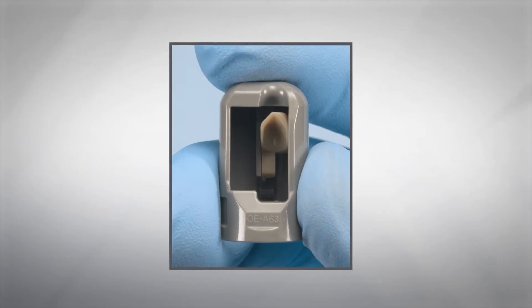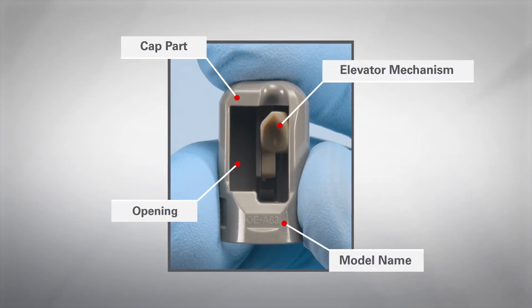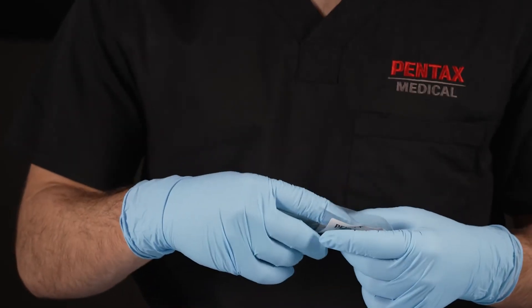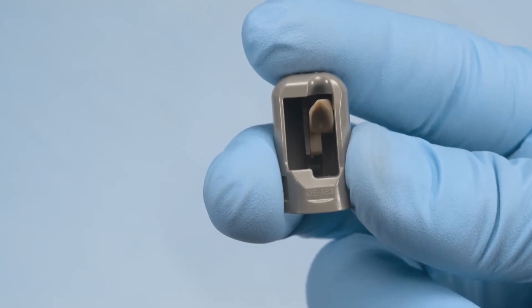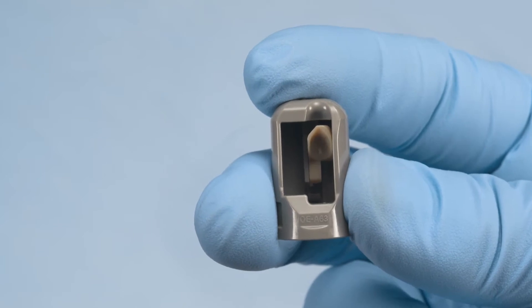Inspect the components of the elevator cap, including the opening, cap part, elevator mechanism, and model name. Check the distal end cap for any abnormalities such as cracks, abrasions, deformities, chipping, discoloration, or the presence of foreign materials, and ensure that there are no missing components.